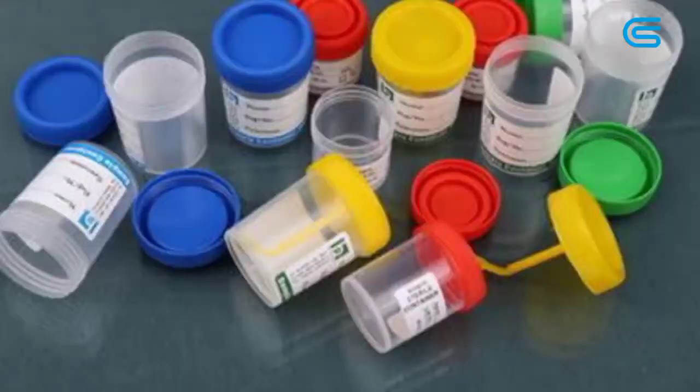So right away, let us move to the collection and preservation of urine specimen. How do we collect the urine specimen, and how do we preserve the urine specimen? Urine must be properly collected, whereby we use urine containers that are clean and dry. There are many types of containers used in collecting urine. We have disposable containers or plastic or coated paper, available in many sizes and are provided with lids to reduce bacteria and other types of contamination.